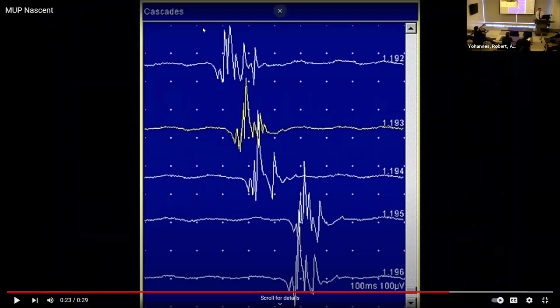Okay, here they captured several of those in a raster. There's a technique to catch them, to look at the screen, and when we catch them individually and freeze them, we can actually measure. We can measure the width. We can measure the amplitude.